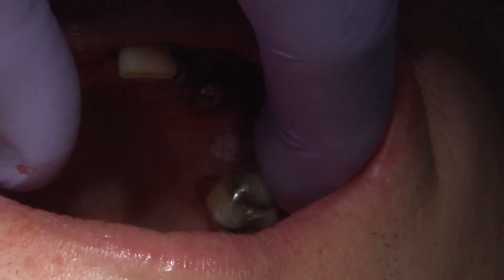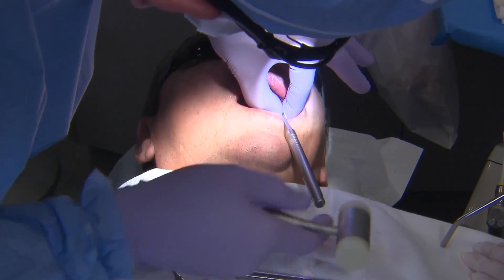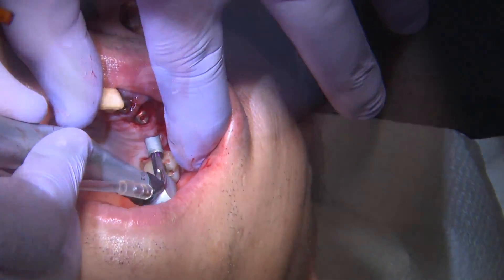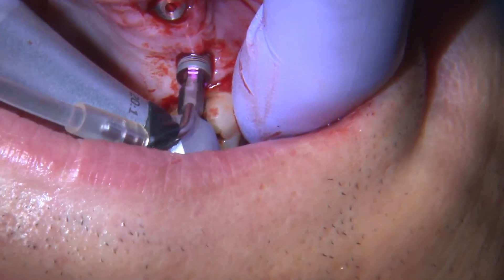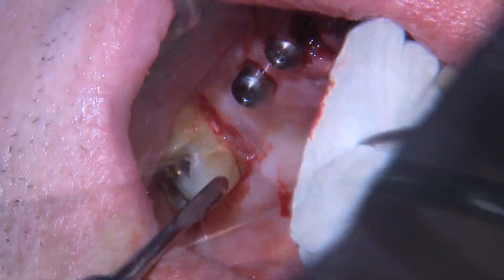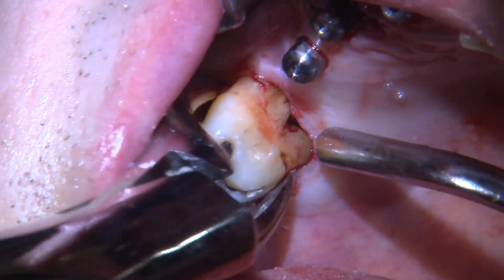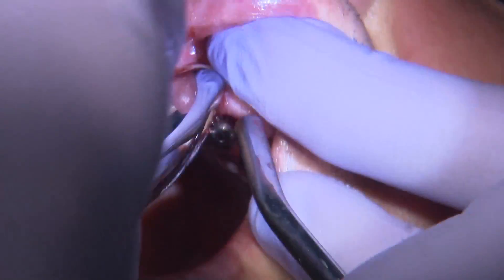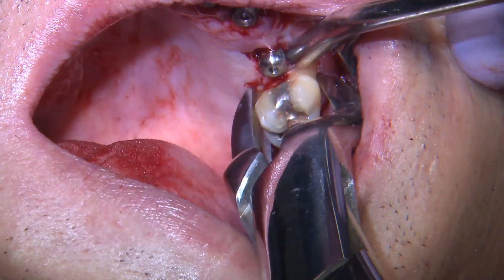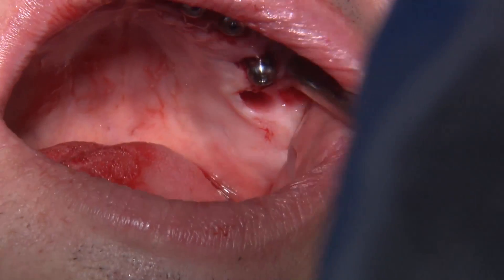For one tooth on the maxillary left, I had to perform a sinus lift using the Summers crestal approach and then place the implant. This implant was not fully placed utilizing the guide — the initial osteotomy was, but the final placement was done without the guide. Once all implants are in place, I go ahead and extract the remainder of the teeth.